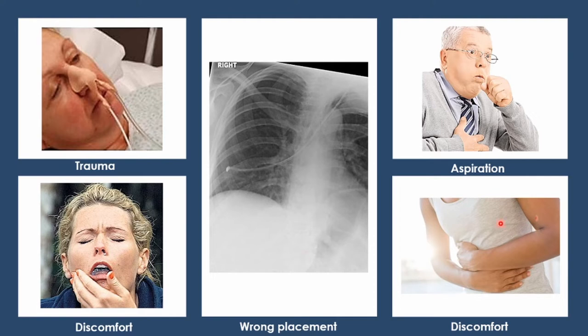Ito yung example ng x-ray kung saan meron tayong maling NG tube placement. Napunta siya sa baga. Nakikita mo to, ma'am. Ayan, one good example. Now, there are other complications.